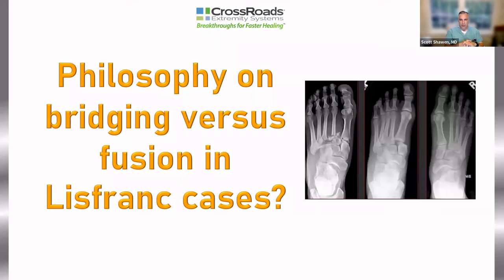For me, it's a young patient with no fractures that I'll tend to do either a bridge plate or a screw technique. If it's homomedial or homolateral and there's not a lot of comminution, I'll typically bridge it. But if any one of those 3 things isn't there, divergent Lisfranc, lots of comminution, multiple fractures into any one of those joints, I start thinking fusion pretty quickly.